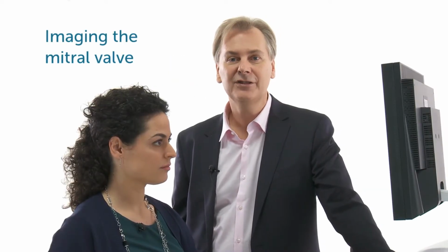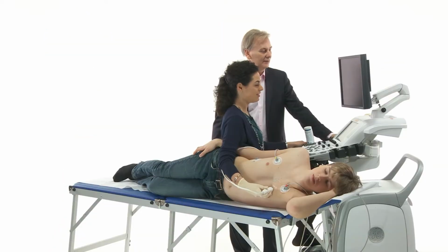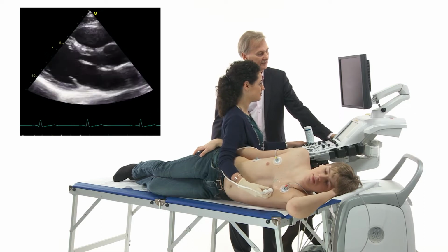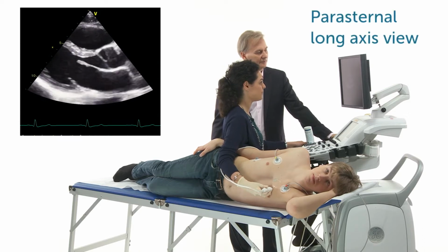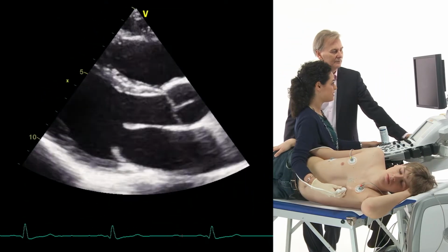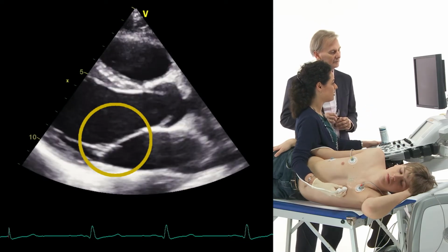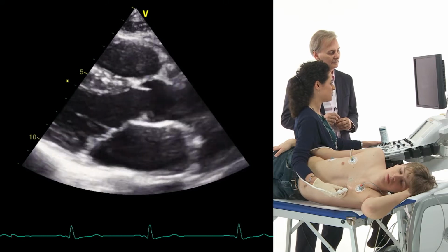From video images of the mitral valve to the mitral valve we see with echocardiography. Exactly, Thomas, here is the mitral valve. I guess our colleagues are already able to recognize this view. We are using a parasternal long axis view, but now our focus is on the mitral valve. So we can see the mitral valve is opening during diastole and closing during systole. I think it's a normal valve. What do you say, Thomas?